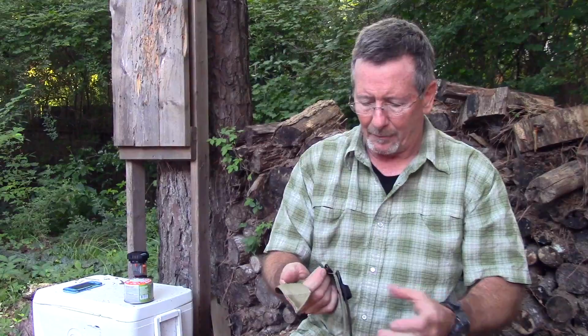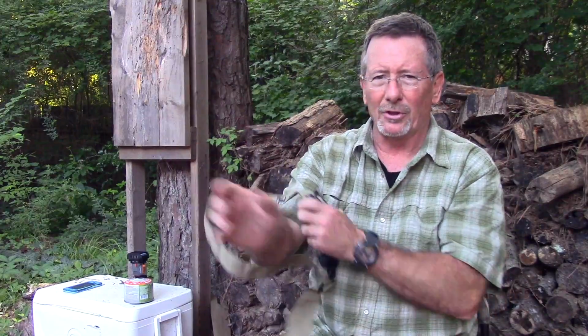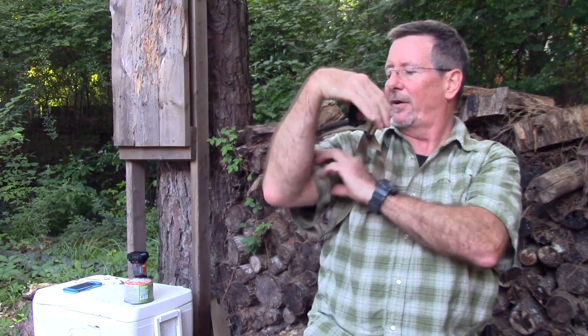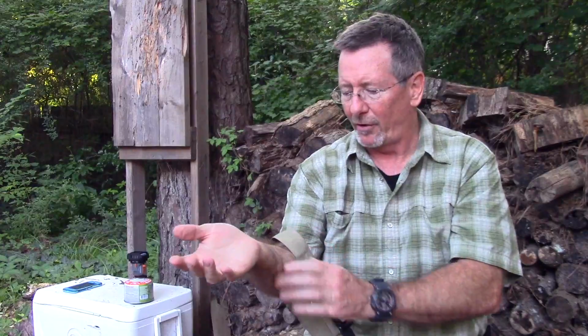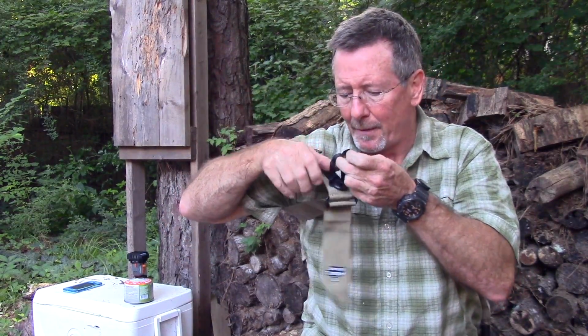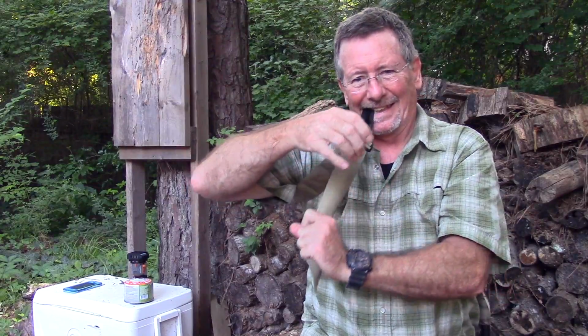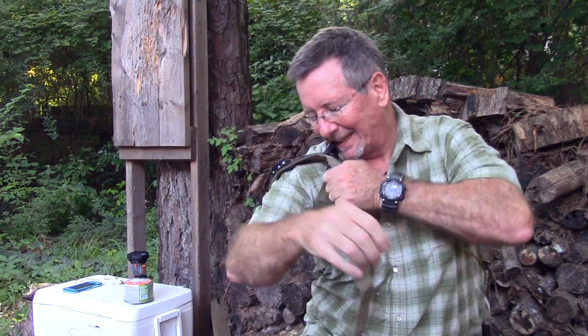And the challenge for me comes in, say you're shot in the arm, either arm, and I'm going to do it on my right arm because I am right-handed. So that'll be the most difficult place, I would think, to do it. And what they say to do to tighten it up, say you were shot here, or cut here, maybe if somebody attacked you with a knife, or you just cut yourself and you've got a bad bleeder there, is you hold this with your teeth, and then pull it shut, all right?